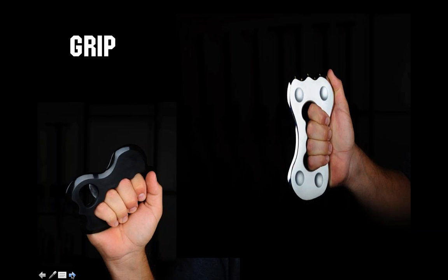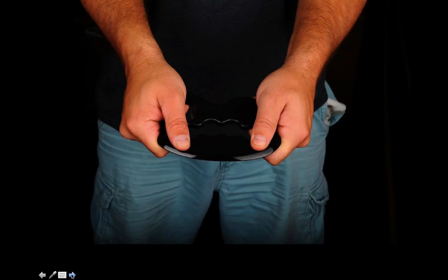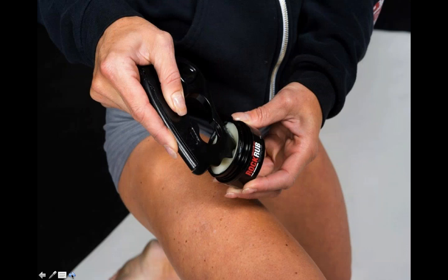But you see all those finger pads on there. That means that we can hold a tool in about 8 different positions on each side. Some pads, depending on the type of tissue you're treating, quad, low back, hamstring, you use a convex side. The convex side introduces a lot of stimulus into the system. So I tell people to go easy, the graded exposure idea. And then you can go harder and harder as you wish, as long as you're not causing that petechiae effect.